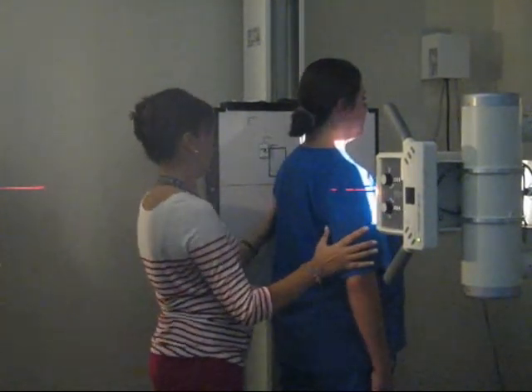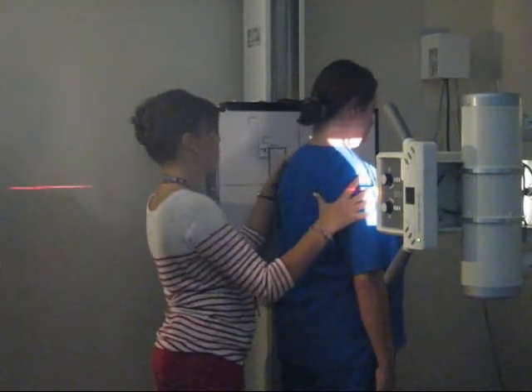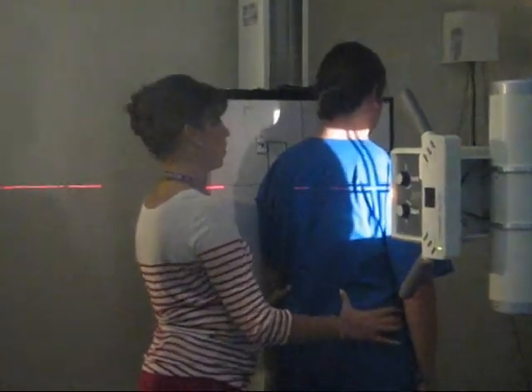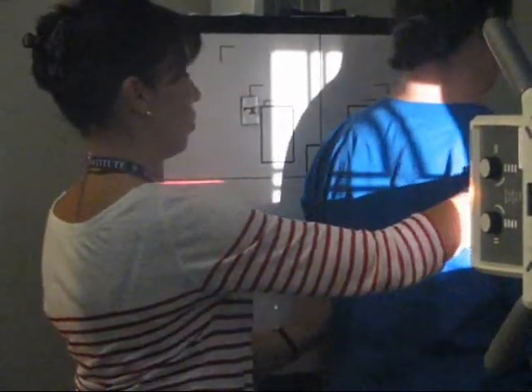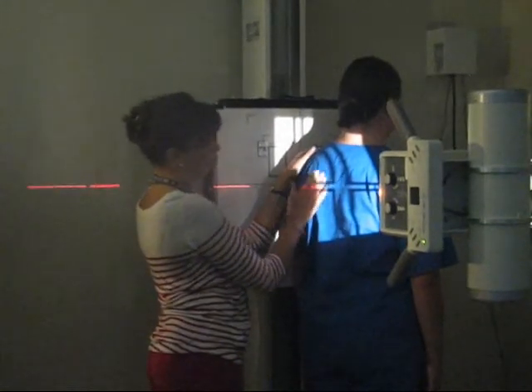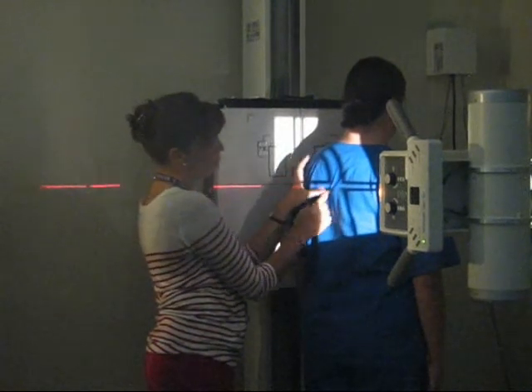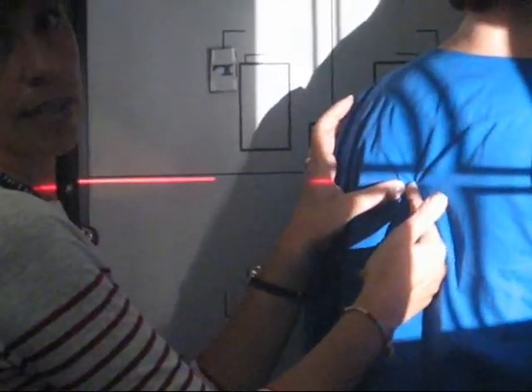And what you're going to do is you're going to keep your patient just straight, standing up straight, but you're going to turn her oblique. Go ahead and step forward. There you go. Not so much. About 35 to 45 degrees, okay? So basically what you want, if you put your fingers through here and kind of feel her scapula, you want the CR to go kind of in that space where the scapula kind of juts out.